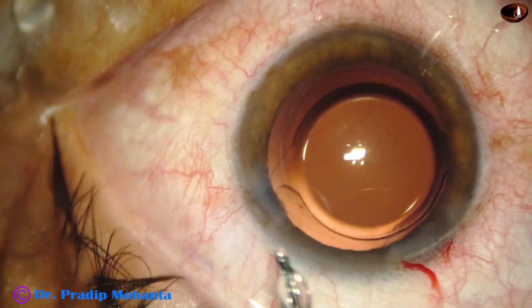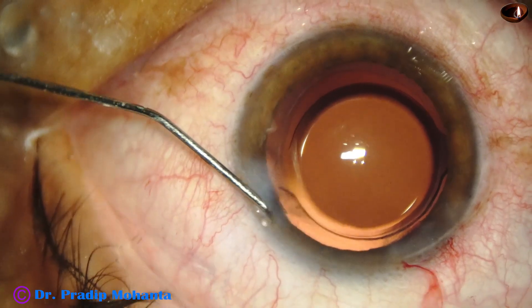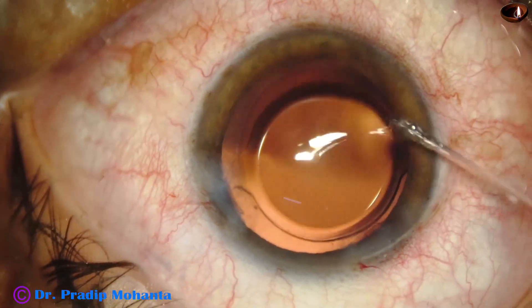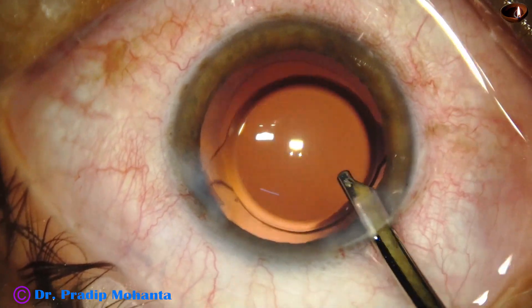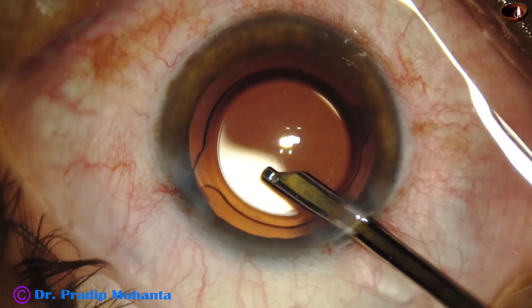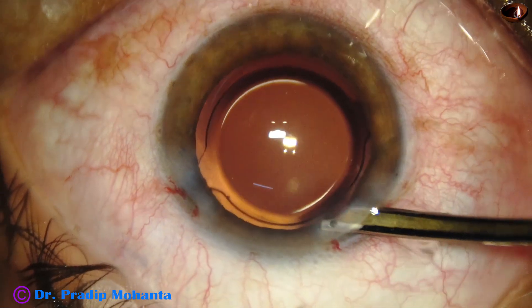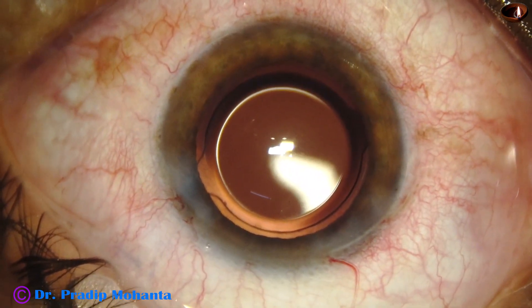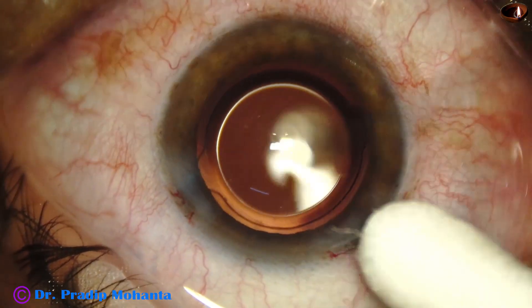And now, corneal stroma is hydrated with BSS and the side port closes nicely. If we do not stress the wounds, the wounds are usually self-sealing. The main wound has not been stressed at all, and it will seal automatically — it will not require any hydration. The anterior chamber is nicely formed. Integrity of the wounds is checked with BSS by a cotton-tipped applicator.